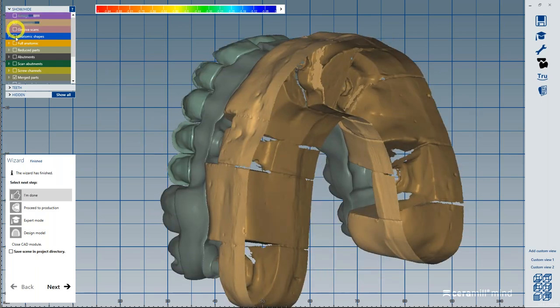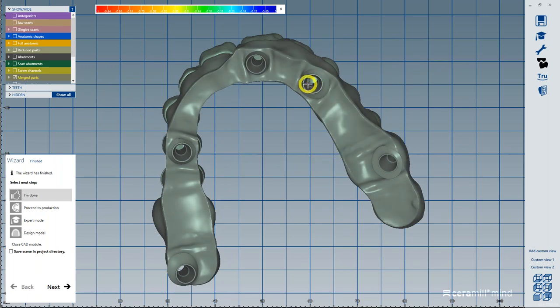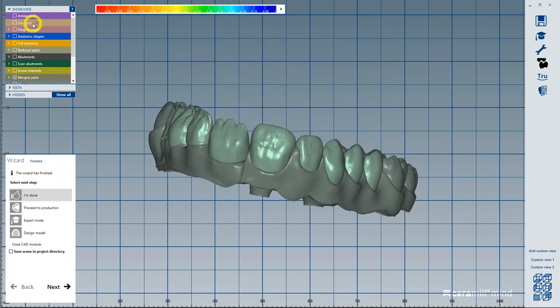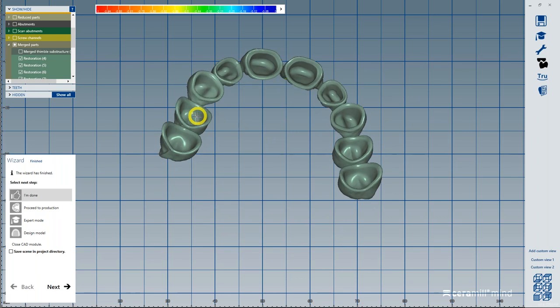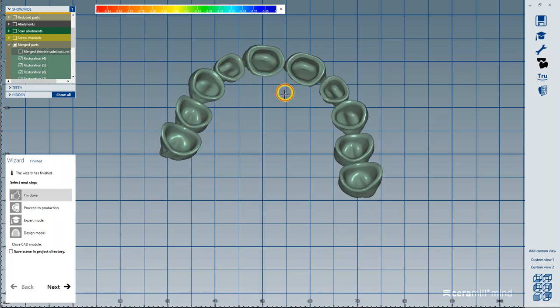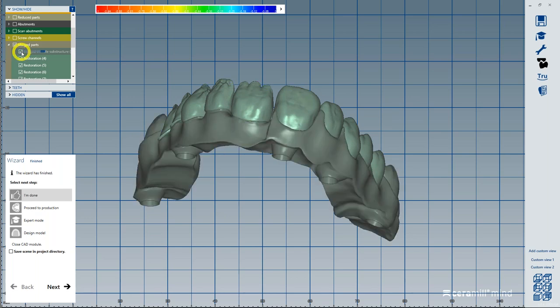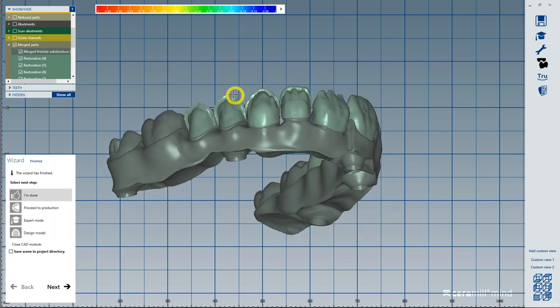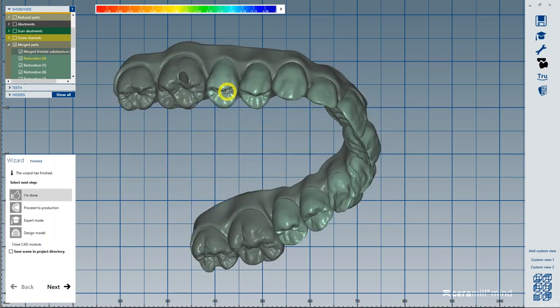So if we remove the jaw scan, you have the underside, you have your implant locations. Let's toggle off the framework. There's your restorations on top of your framework, also with your screw channels in the right locations.